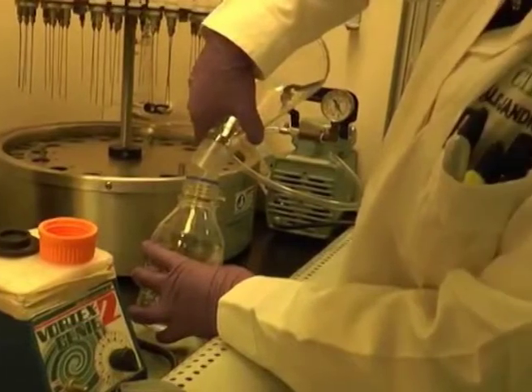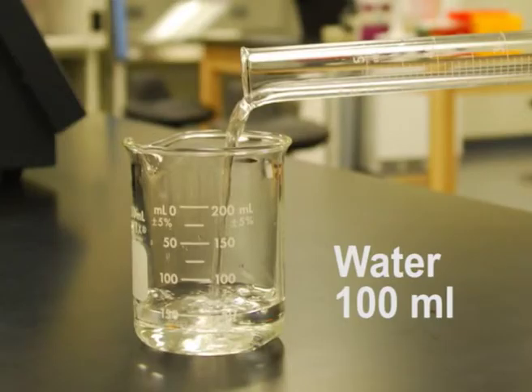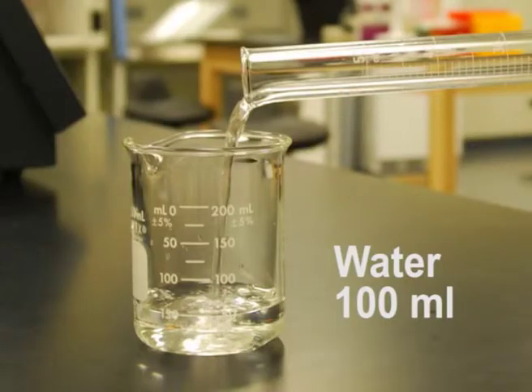Preparation of Dragendorff reagent. Mix together 2 grams of bismuth subnitrate, 25 ml of glacial acetic acid and 100 ml of water to produce solution 1. Dissolve 40 g of potassium iodide in 100 ml of water to produce solution 2. Mix 10 ml of solution 1 and 10 ml of solution 2. To it add 20 ml of glacial acetic acid and add 100 ml of water.